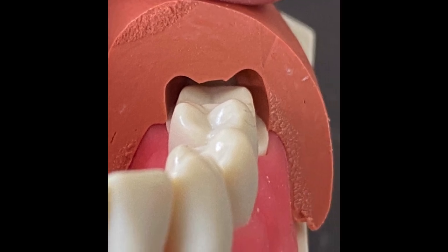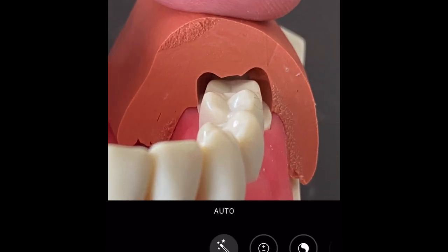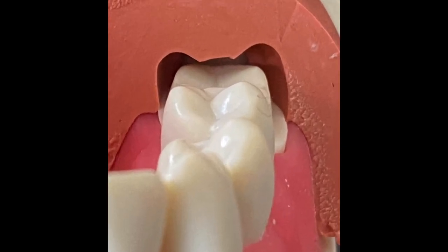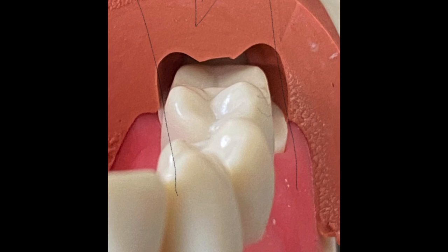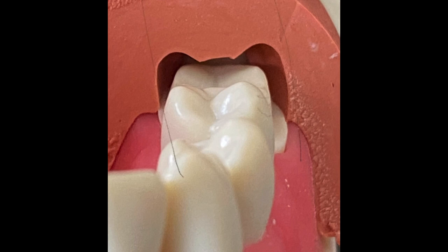What generally happens — and we've discussed this — look at the putty, not the tooth. Look at the putty. What generally happens is the molar, which is the 46 and 36, has a 15 degree palatal inclination or palatal tilt. So the straight line axis of these teeth is not straight up. These are the only teeth whose straight line axis is tilted like this. Look at the putty for this — so when you see it from the occlusal view, you will not be able to see the full margin on the palatal.